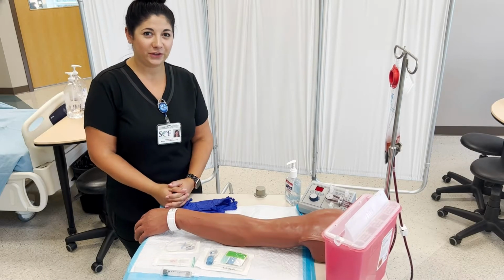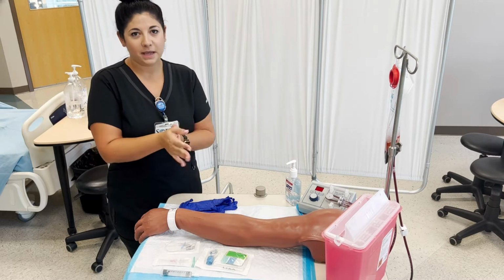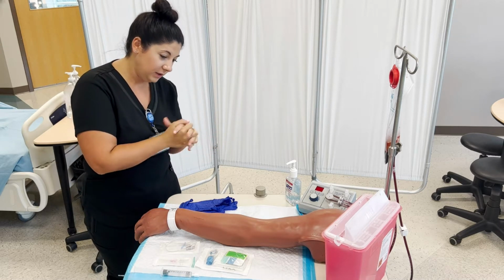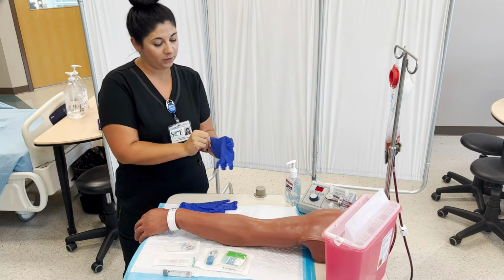I'm now going to show you IV insertion. I have knocked on my patient's door, introduced myself, washing my hands. I've explained what we are going to do. I will identify my patient. Can you tell me your name and your date of birth? Okay, and I'm verifying that against my order.